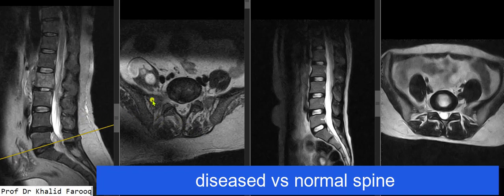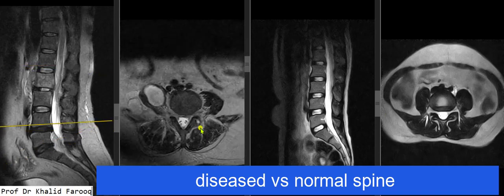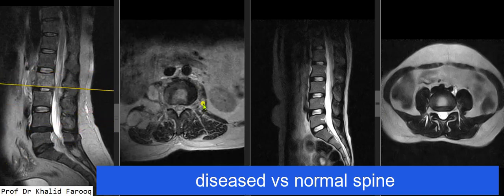Here we can see multiple variable-sized collections or abscesses in the right psoas muscle, which is swollen, while the left psoas muscle shows normal signals and morphology. In this patient, there are abnormal signals in both psoas muscles and in the right quadratus lumborum, suggesting an inflammatory process with tiny collections in the left psoas muscle.